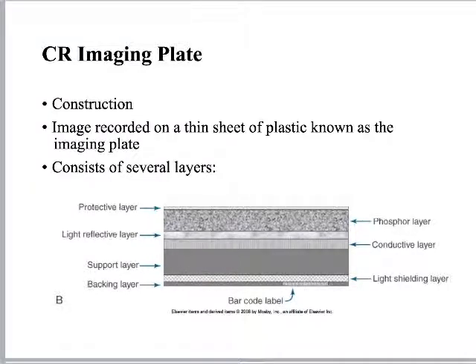It's there so that we can identify it. We know it's definitely the picture that we say it is, right? Because otherwise it's just a weird piece of white plastic. So again, like I said, it's important to know this sandwich diagram, to know why these things are there and why they're important. And we've kind of walked through it. We'll go through it a little bit more.